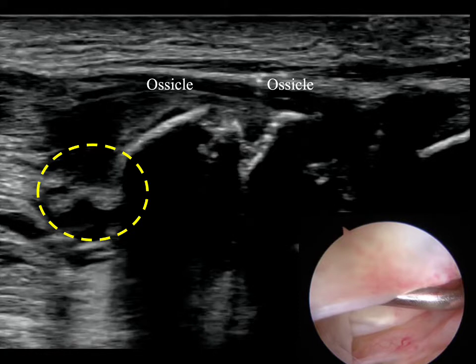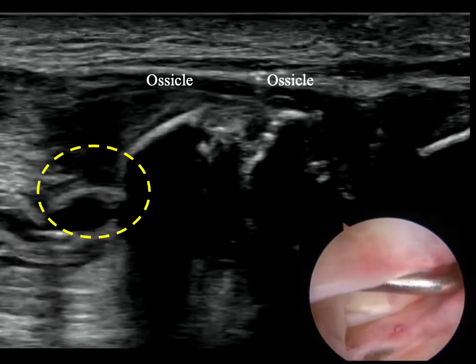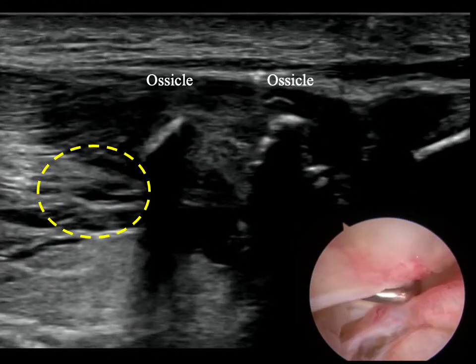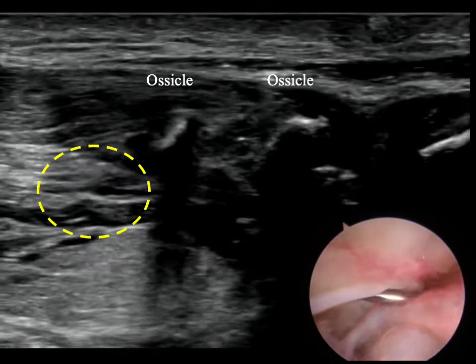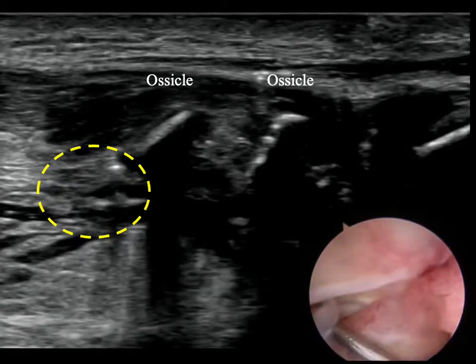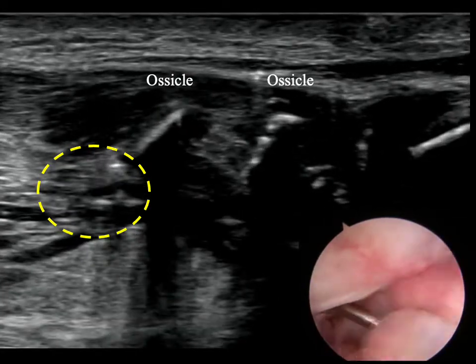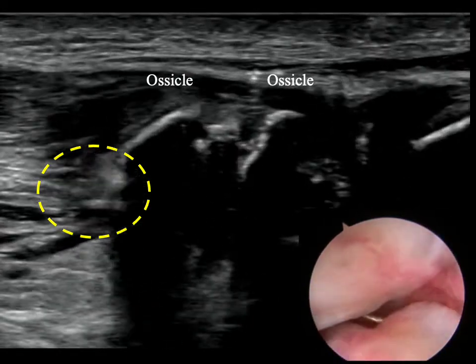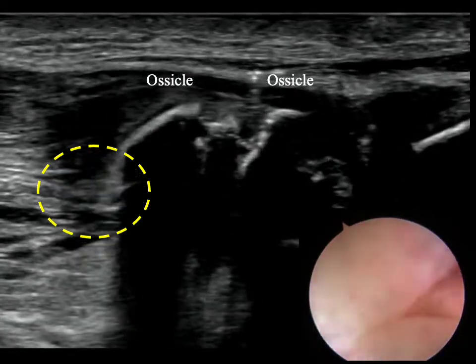The ossicle can be identified by touching it with an arthroscopic probe, confirmed in the ultrasound image. We can see that the probe is in the area circled by the dotted yellow line.